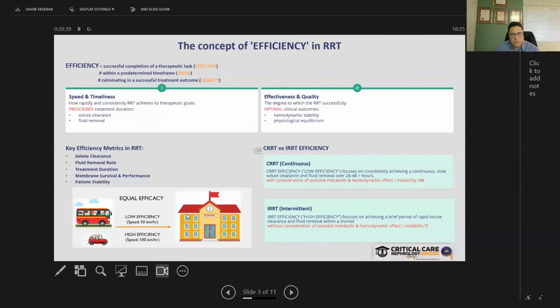Both of those parties reaching the school reach the same efficacy, and there is no insistence that the bus gets there at the same time as the parent. This is a poor analogy, I think, but for me, I always think that I'm as effective with a slow means of therapy as I am with a high means of therapy, and maybe even safer.